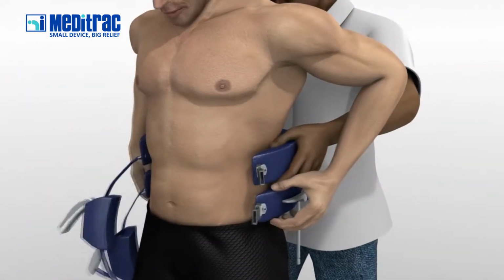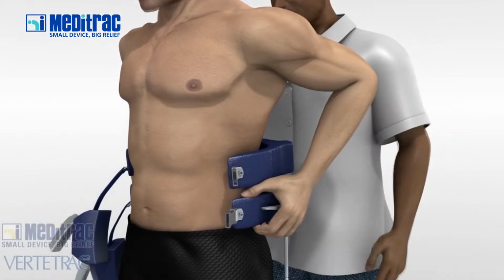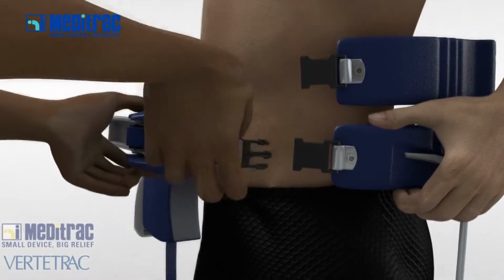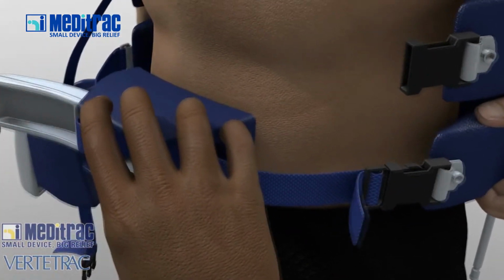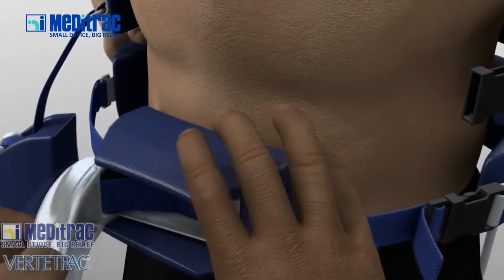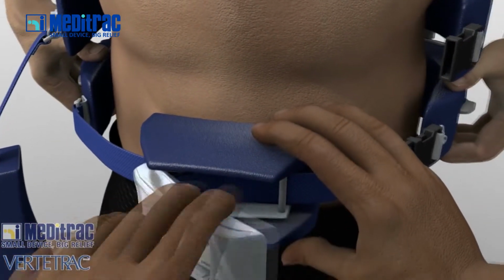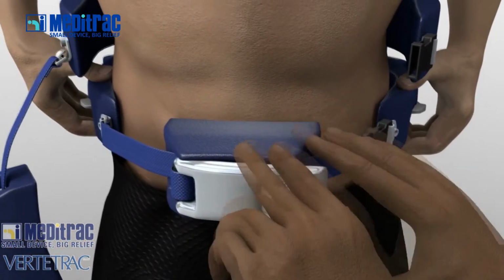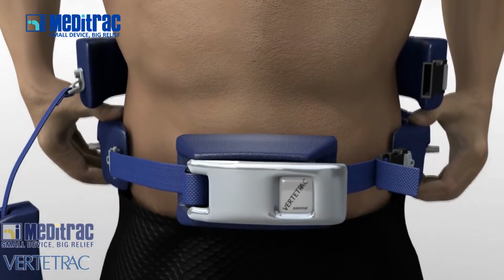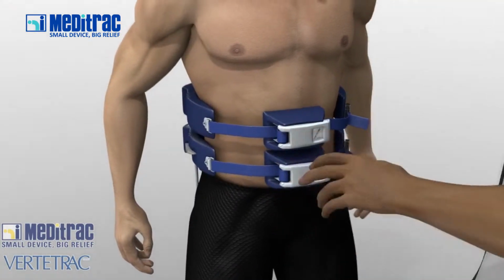Begin adjusting the lower belt so that it fits tightly around the body. The lower belt should be sufficiently tight to prevent slipping of the apparatus during the treatment. It is recommended to center the ratchet horizontally on the belt, but this position may be changed as different patients may require a different position. Tightening of the upper belt should ensure that the upper frame is well pressed against the body so that no space remains between the upper frame and the skin.